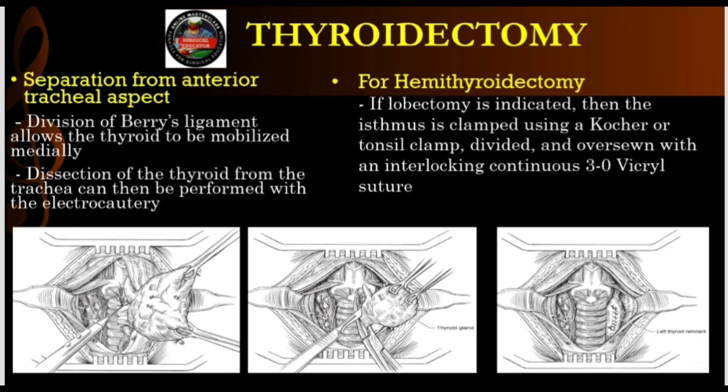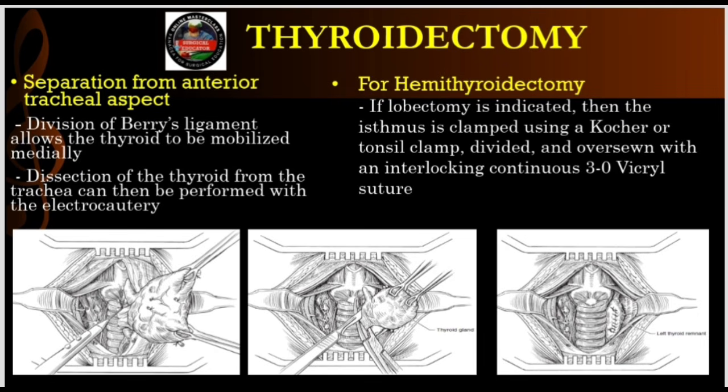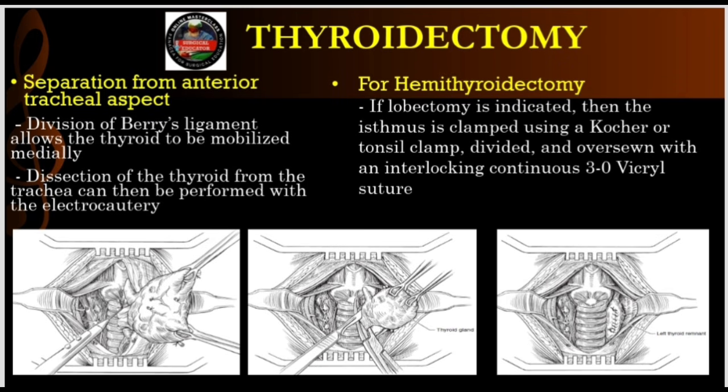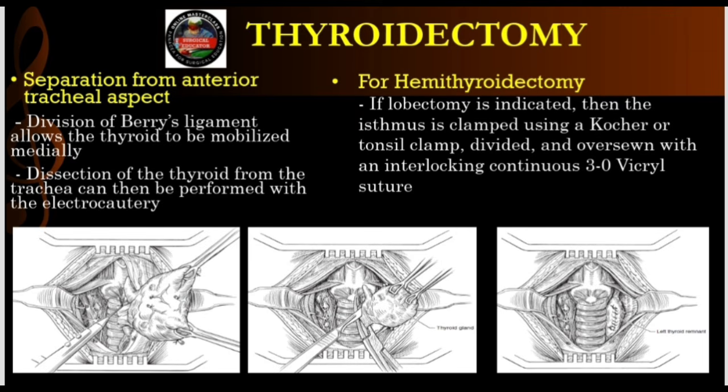So we use 3-0 Vicryl, an absorbable braided suture, to permanently sew it shut using a continuous blanket stitch. An interlocking chain. Like a series of micro tourniquets that physically strangle every little blood vessel. You take the clamp off and it's bone dry.